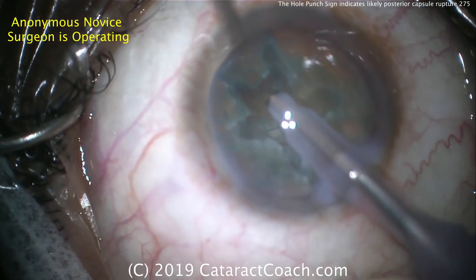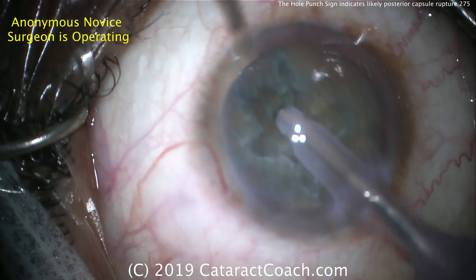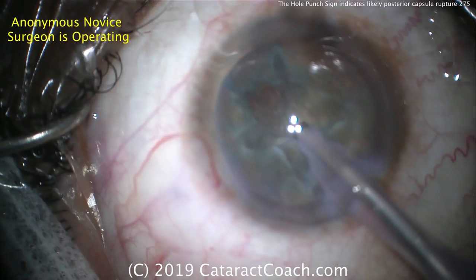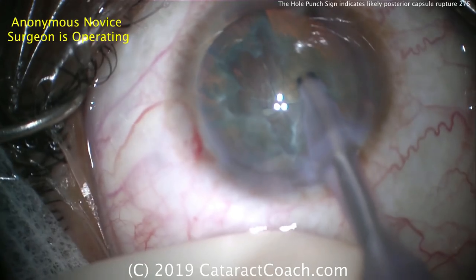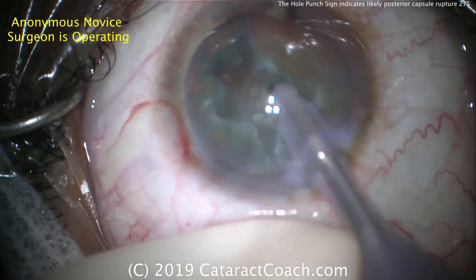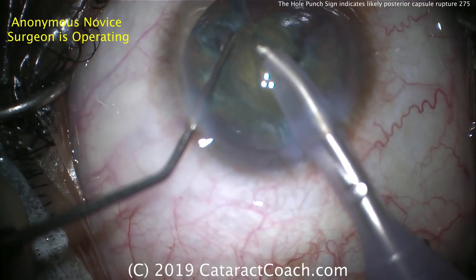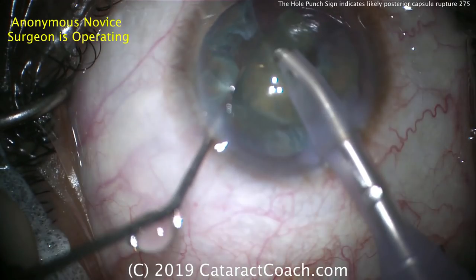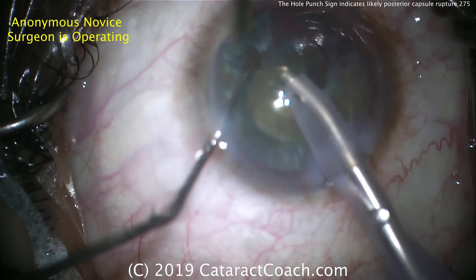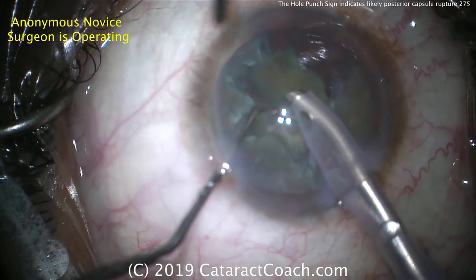There's the hole. Do you see that clear orange gap? That was the punched hole in the posterior capsule. This piece of nucleus has been punched through and the posterior capsule has been hit in that quadrant. The reason behind that is incomplete separation of the nuclear quadrants — despite using high vacuum, one quadrant was unable to be pulled out of the capsule bag.